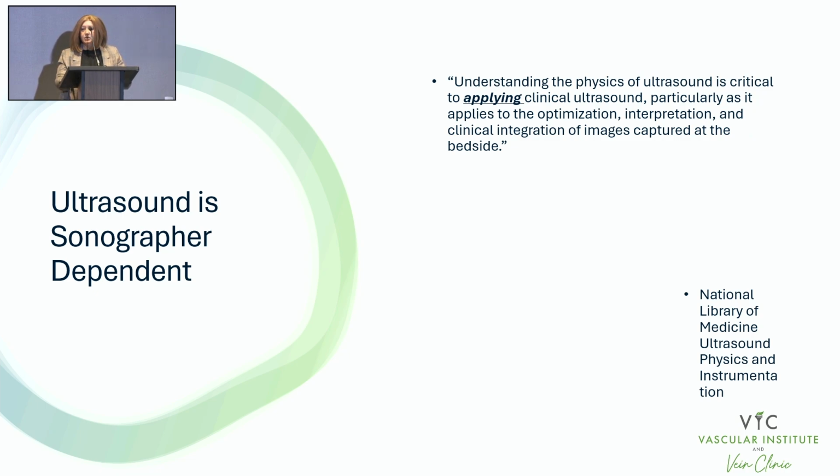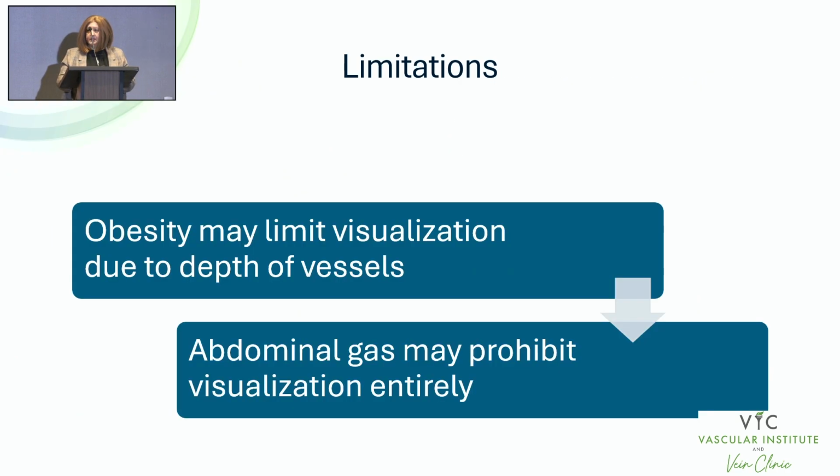In the hands of a good sonographer, you can get a diagnostic study most of the time, but it hinges on understanding the physics and then using your critical thinking skills to apply that to your ultrasound. You didn't just learn physics in school to pass the test. You actually use that as a sonographer to be able to get good images because it's so dependent on that.